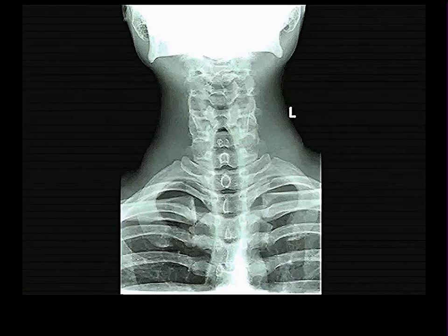Today we'll just do neck, and I don't know, 2 weeks from now or so we'll do head, which is considerably more complex than that. This is probably an AP film, because probably the person's back was against the receptor, and the x-rays are coming from the front. This is an AP film of the neck. This is not very revealing of anything.